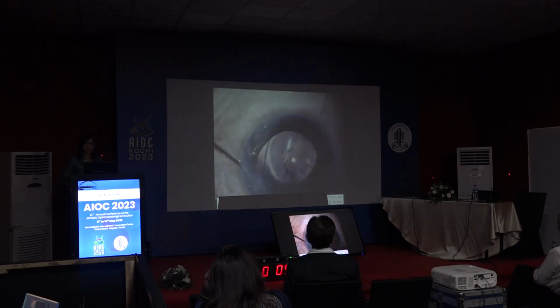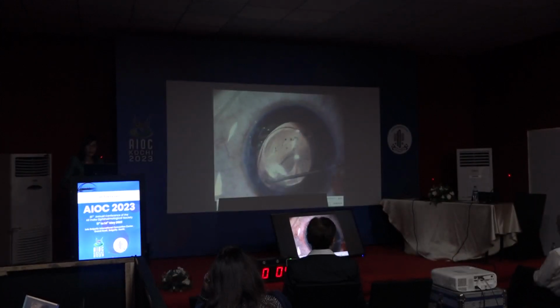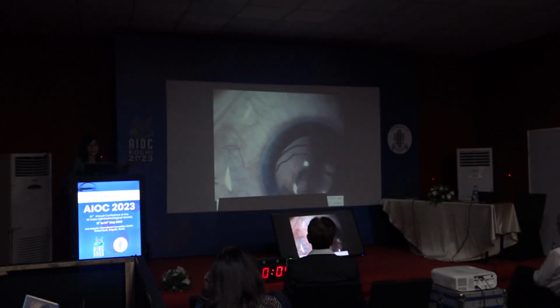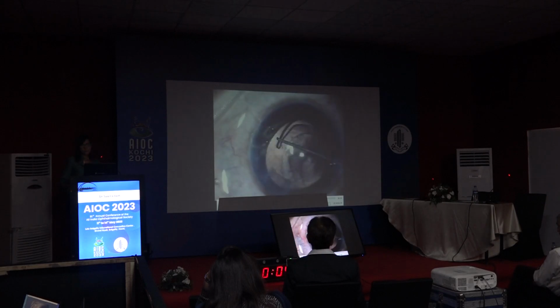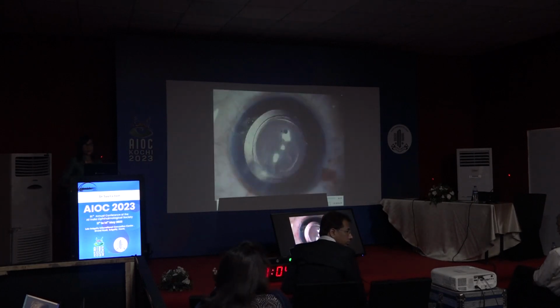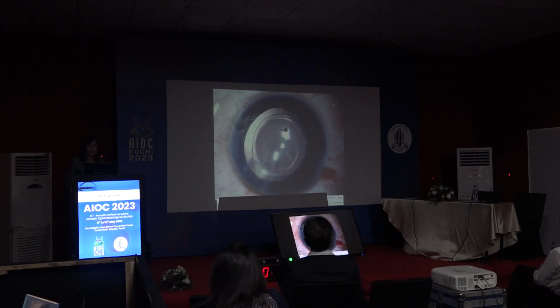And I actually managed to put in a single-piece monofocal IOL in the capsular bag with care and caution. And then I rotate it. You always rotate these lenses to come to lie at right angles to the tear. Center it well, remove the viscoelastic, and then you can be quite happy with the end result that you have achieved here.